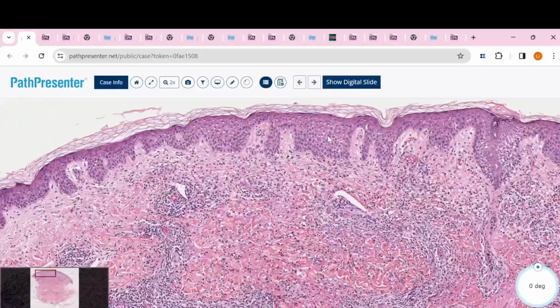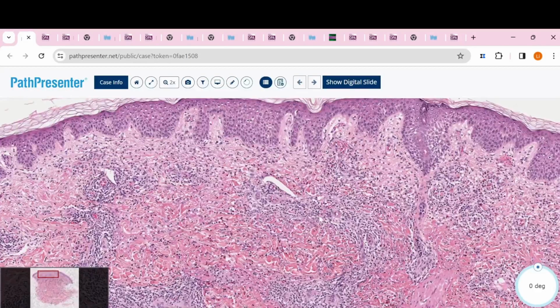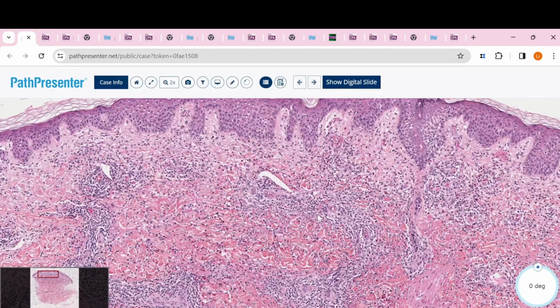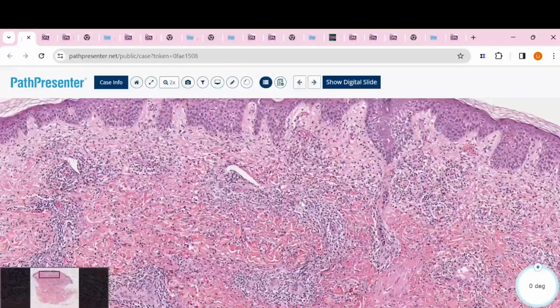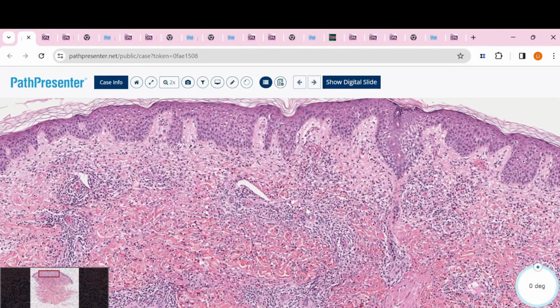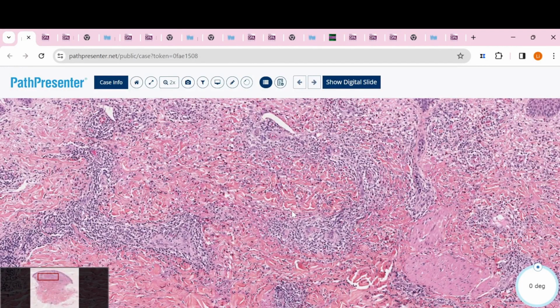If the spongiosis is not really dramatic, or the changes are just in the dermis, we will also use the term DHR, dermal hypersensitivity reaction. So if you see tons of this reaction, you will be highly suspicious of something like tick bites, arthropod bites, even scabies. We have scabies in some slide in today's review. But some people are also thinking, could it be a lymphoma? Yes, why not? Because this reaction is so dramatic. Some people will say pseudolymphoma, something like this, to describe it.